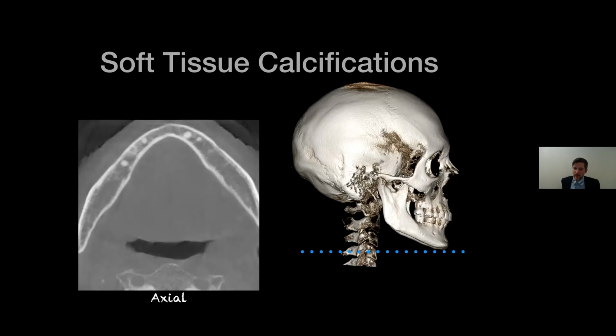And the same person asked, is it recommended to take a separate pan from a cone beam, because the CBCT cannot make real panoramic reformats? Yeah, the resolution might not look as pretty in the reconstructed pan, but I would still use that and go through the slices, because you can evaluate the periodontium better in a cone beam than a pan. So personally, I would not recommend taking a pan just to take a pan because it might look a little better.